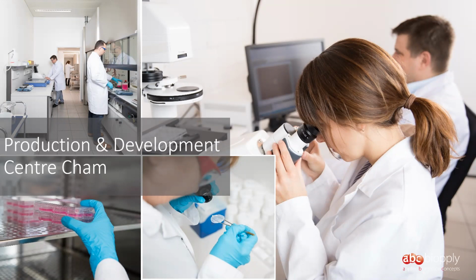After that, cells can be added in a similar way as they would be seeded normally onto 3D CoSeedis chips, and they then can grow and incorporate those Matrigel or collagen particles, and that helps some cells to form 3D aggregates. Some of these extracellular matrices then get eventually digested, others stay there. That depends a lot on the cell type as well, but experiments like that have been done, and they look actually quite interesting.